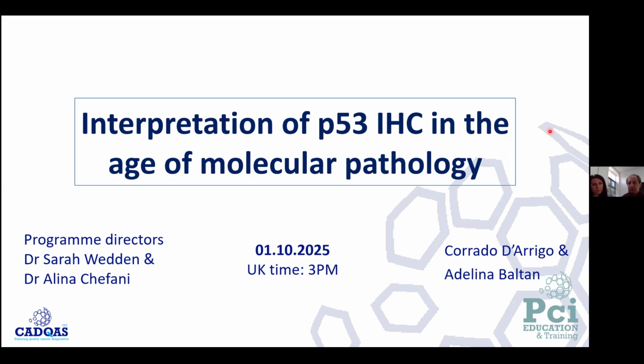For many, many years, BRAF V600 antibody was my favorite antibody. I could see the mutant protein. It was amazing for me. But it also gives you a picture of the microenvironment, and in many pathological conditions, the microenvironment is very important. You don't want to grind it. You want to know which mutations are in which position in the tissue.